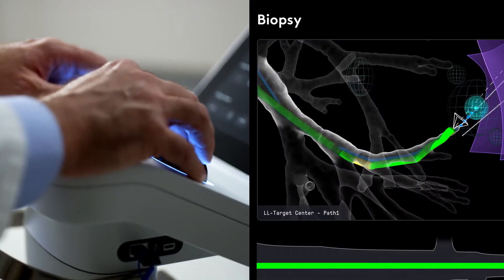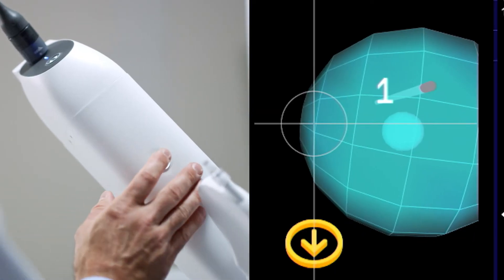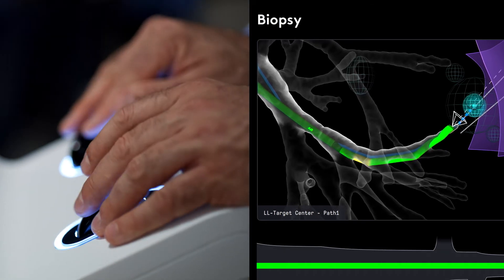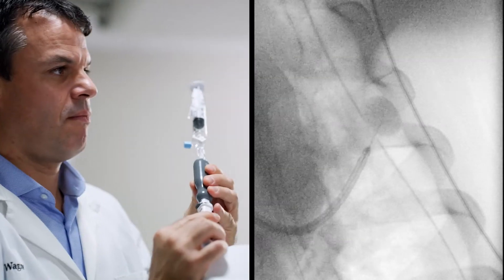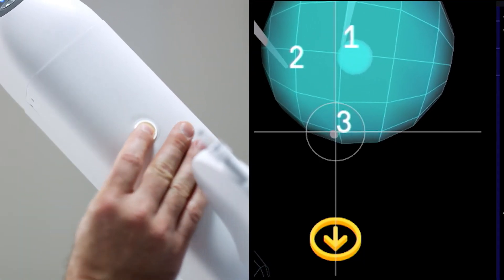The user can precisely steer the biopsy needle into different areas of the target. If real-time confirmation of a representative tissue sample is available during the procedure, the user can systematically redirect subsequent biopsy attempts into the confirmed target area. We refer to this approach as cloud biopsy.